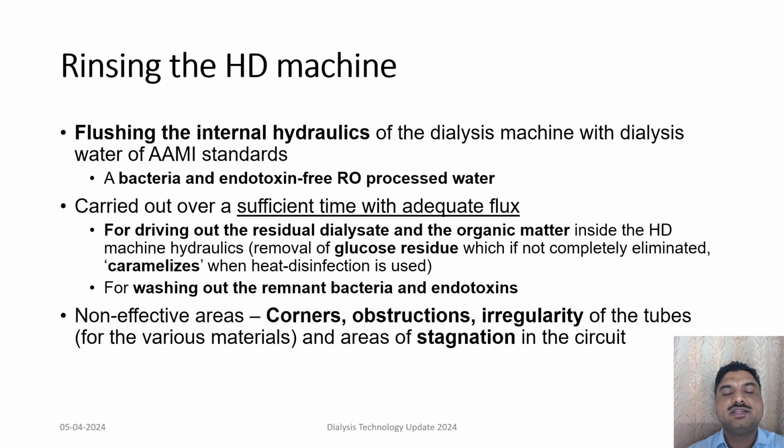However, this rinsing technique is not effective in particular areas of the dialysis machines, like the areas where there are corners, or if there is any obstruction or irregularity in the tubes, or if there is any area of stagnation in the circuit.